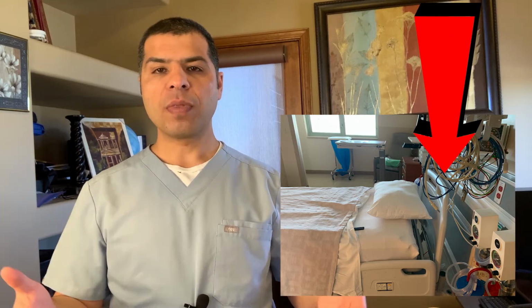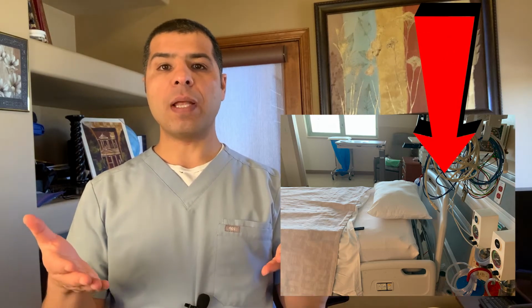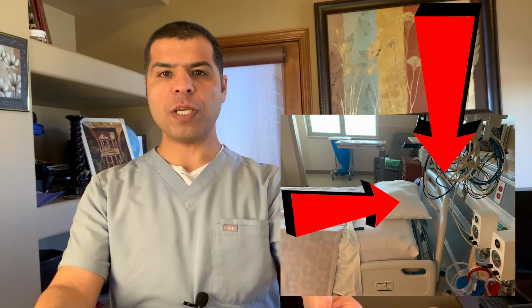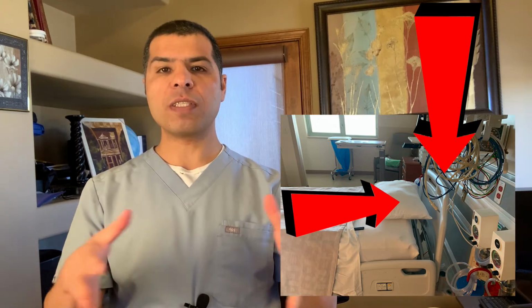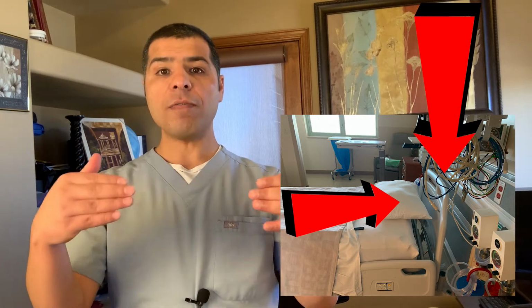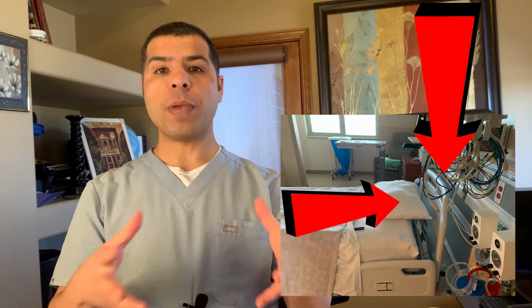At this point, I move to take my position. Usually we stand behind the head of the bed, and I ask them to raise the bed a little bit. So you need to lower or raise the bed to your comfortable position. And I ask them also to drag the patient's head back to me so it's easy for me to reach it. Pick your comfortable position. After that, you need to adjust the patient position.